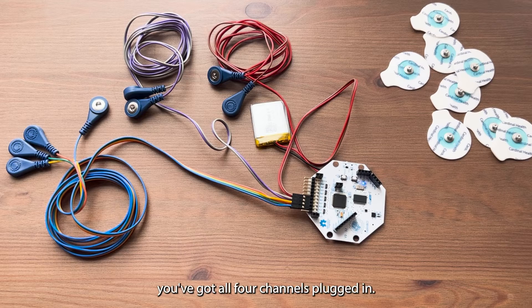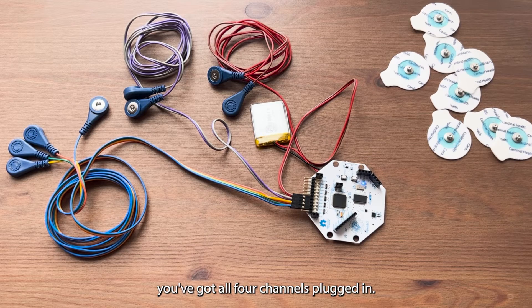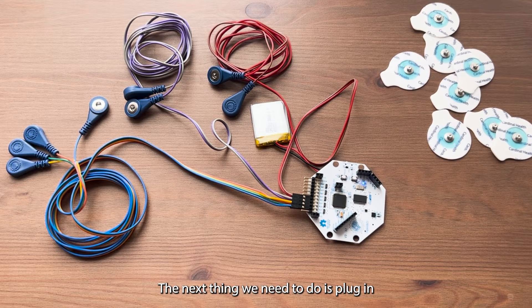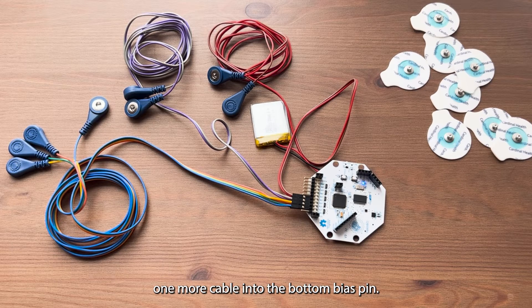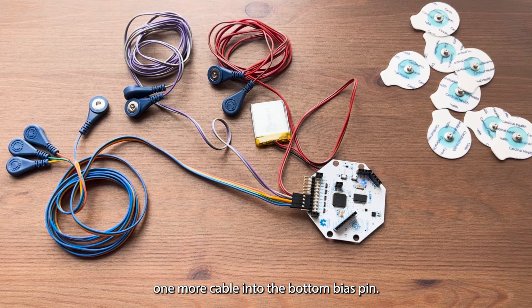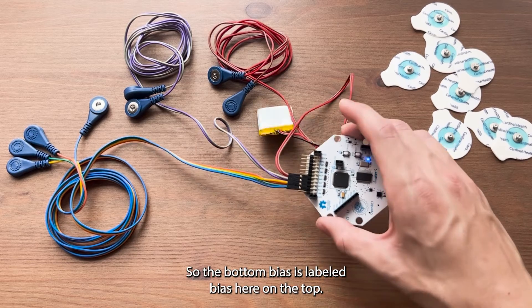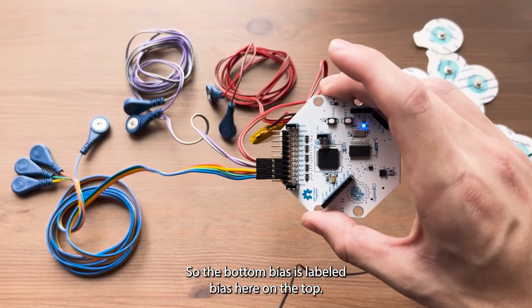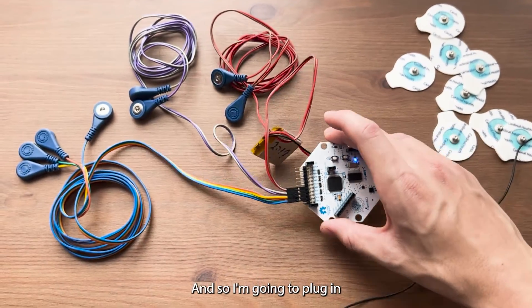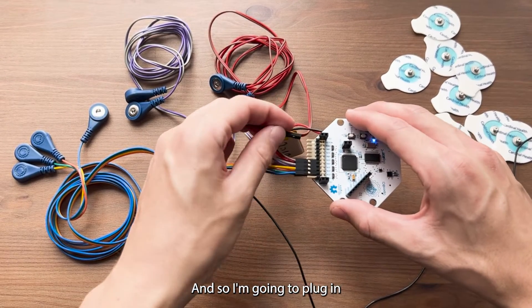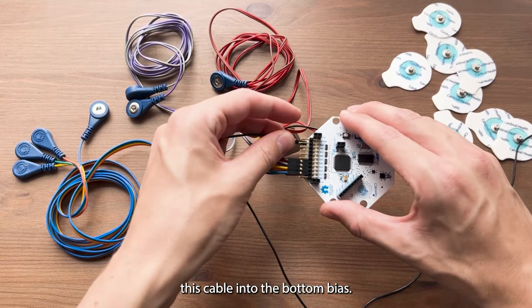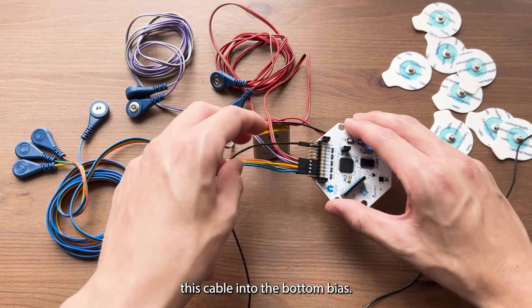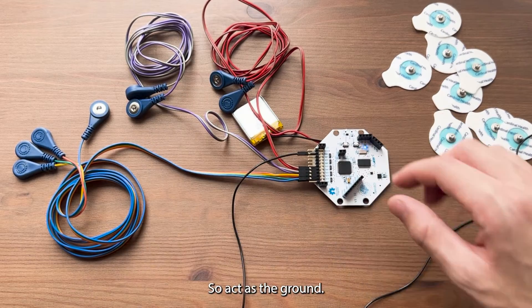After you've got all four channels plugged in, the next thing we need to do is plug in one more cable into the bottom bias pin. The bottom bias is labeled bias here on the top. So I'm going to plug in this cable into the bottom bias to act as the ground.